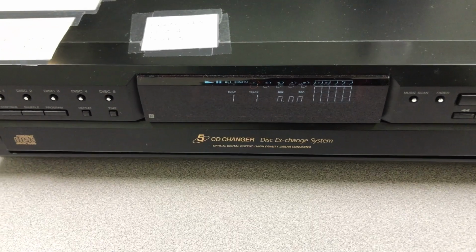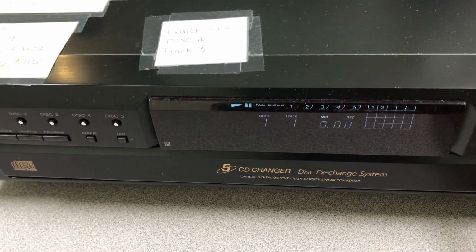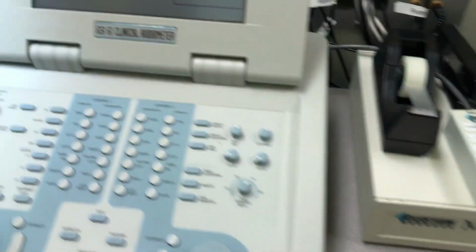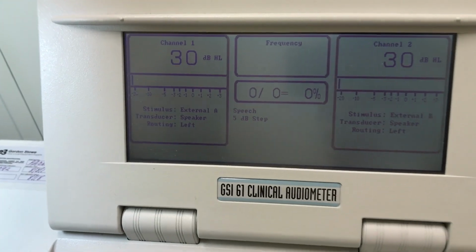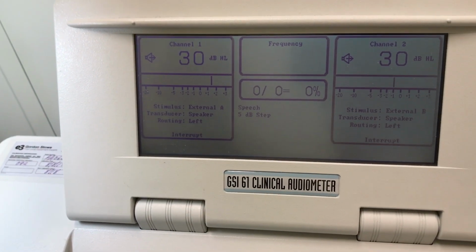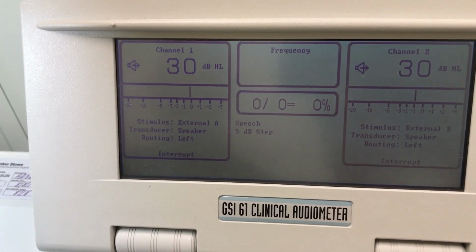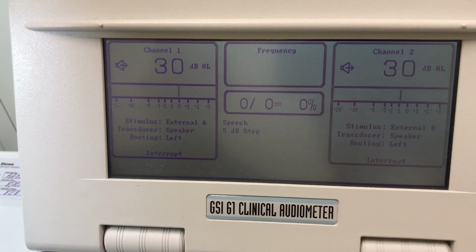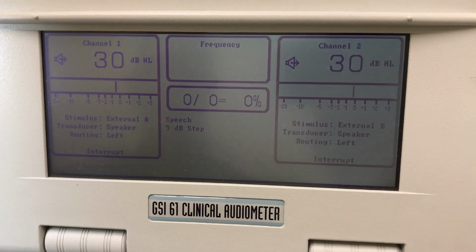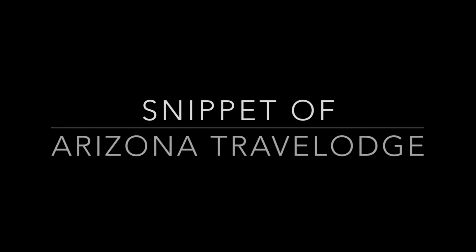The next step is to calibrate your signal. So after placing the CD in the CD player, set it for the track with the calibration tone, hit play. Then on the audiometer, press your interrupt switch for both channel 1 and channel 2 and make the adjustment on your VU meter accordingly such that your VU meter reads 0 for both the left and the right signals. Once you get that established, you are ready to do the test.